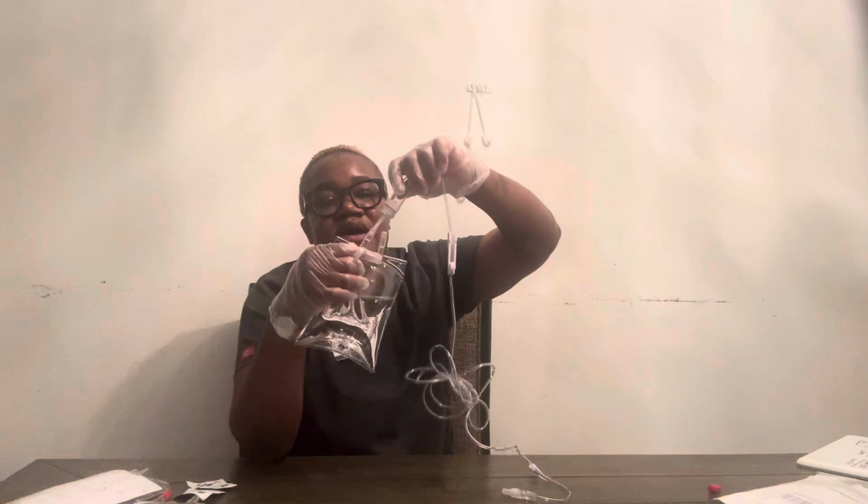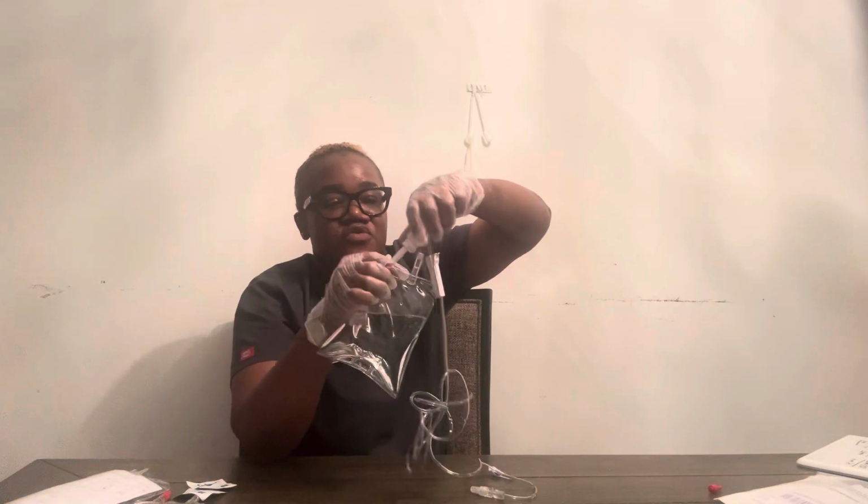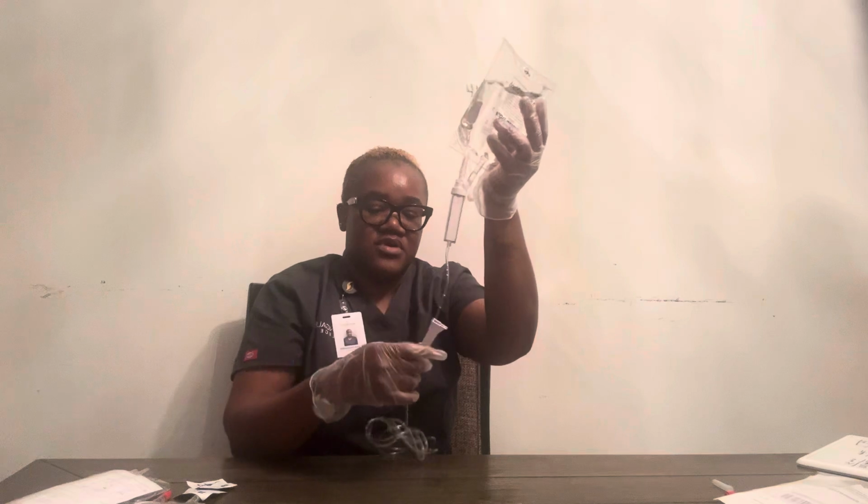Okay, so next I am gonna remove the cap from my fluid. I am gonna remove the cover from my spike, and I'm gonna insert it in the bag. I'm gonna spike the bag, ensure that it goes all the way in. And like I said, I have to ensure that the roller clamp is in a locked position.